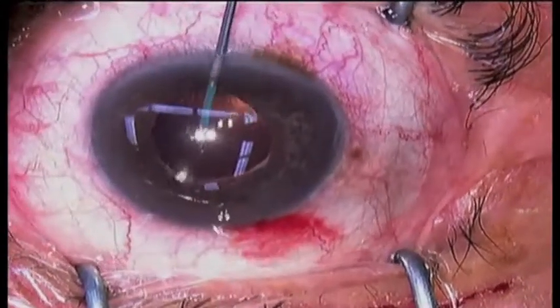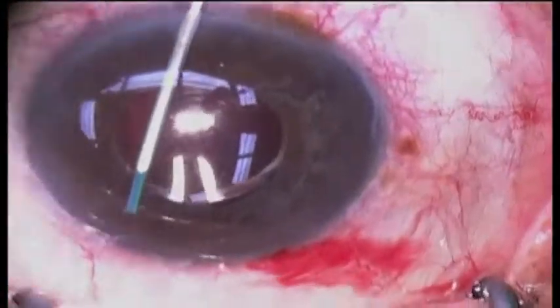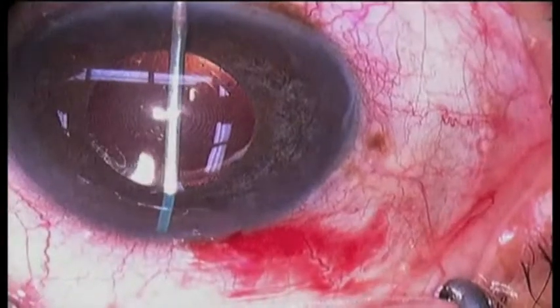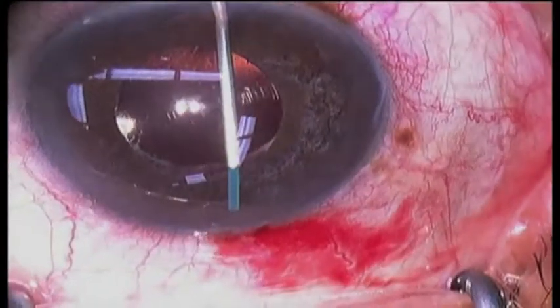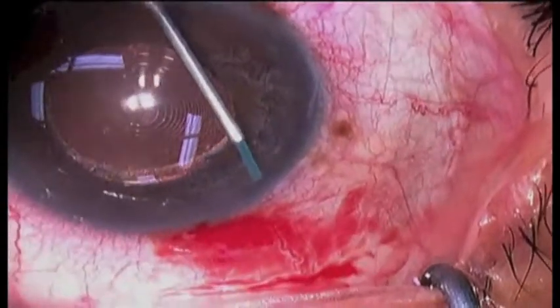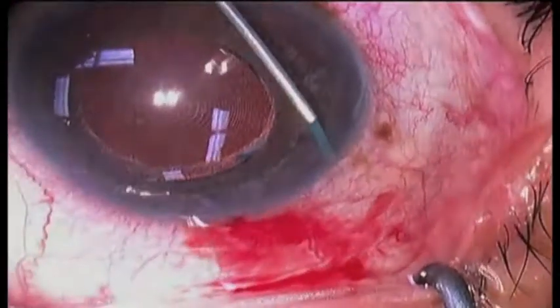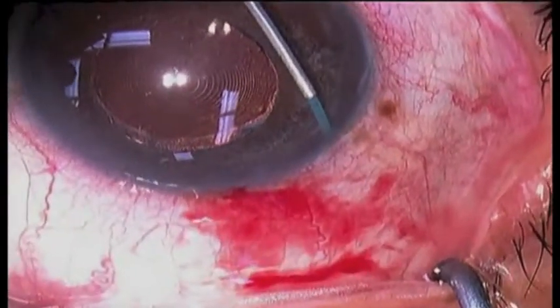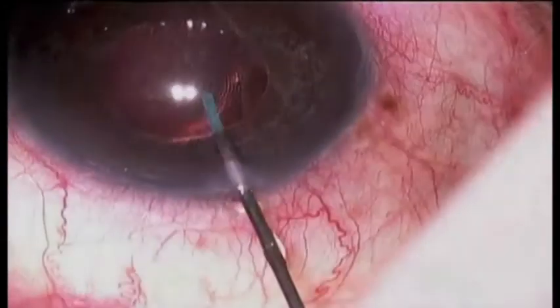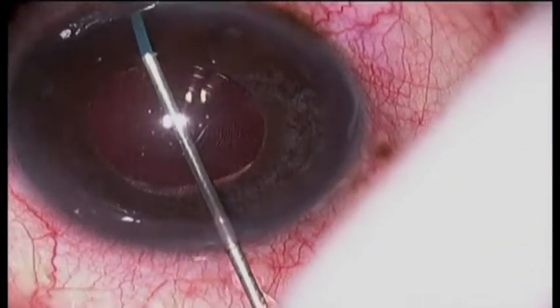Here we're making some paracentesis. This is a 23-gauge retina extrusion cannula that's being used to lavage and vacuum the angle. It is connected to a syringe, and a combination of pumping out and vacuuming in blows away the pigment along the angle. This is done multiple times, brushing along the inferior angle.